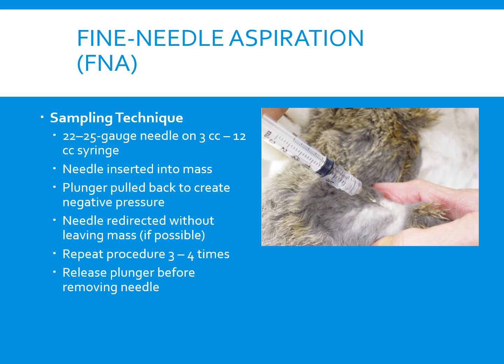The mass to be aspirated is held firmly, to help with the penetration of the skin and mass and to control the direction of the needle. The needle with the syringe attached is introduced into the center of the mass, and strong negative pressure is applied while withdrawing the plunger to approximately 3/4 of the volume of the syringe. Several areas of the mass should be sampled. Again, we want as many samples as possible, but aspiration of the sample into the barrel of the syringe and contamination of the sample by aspiration of the tissue that surrounds the mass must be avoided.